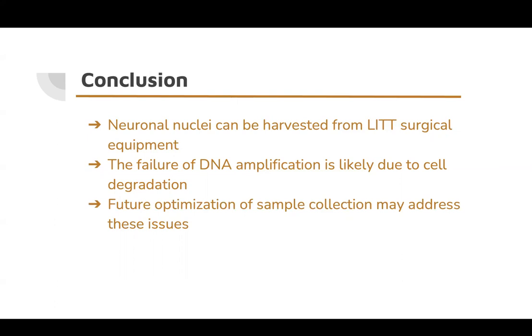Preliminary strategies include using a second obturator during the procedure in case a second trajectory is needed, or putting the original obturator in a sterile fluid between actual uses and then collecting the fluid with the obturator and brain cells afterwards.